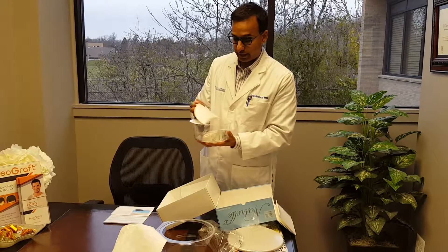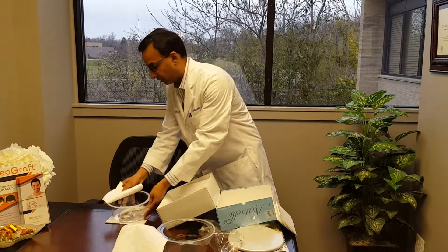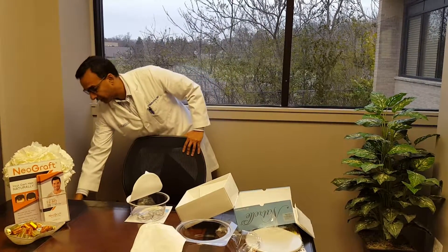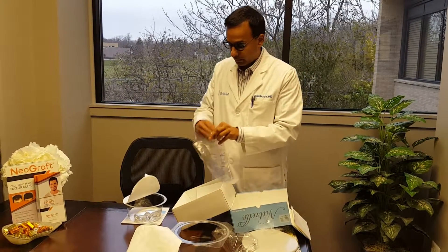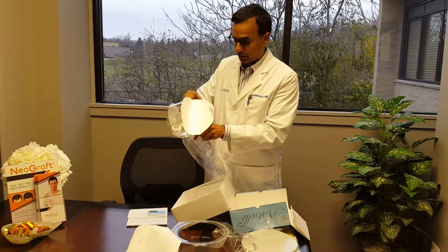She'll open this implant and then very gently place it into what we call the Keller funnel, which is really important with silicone implants. With the Keller funnel, we never touch the implant — it would be directly poured into this funnel.